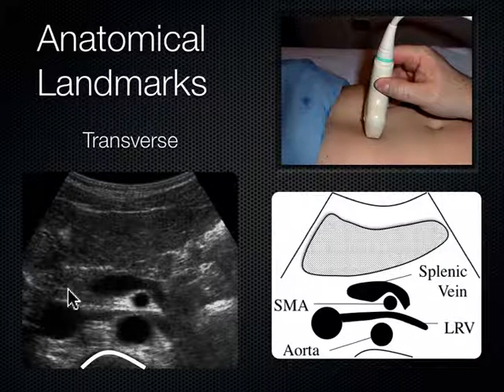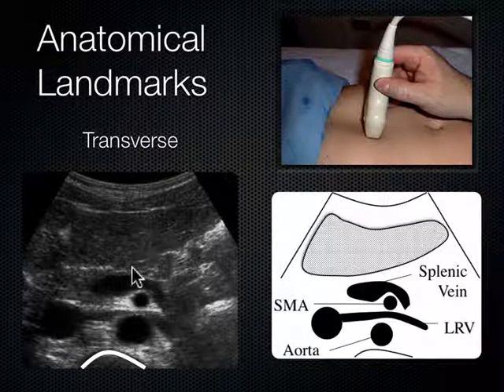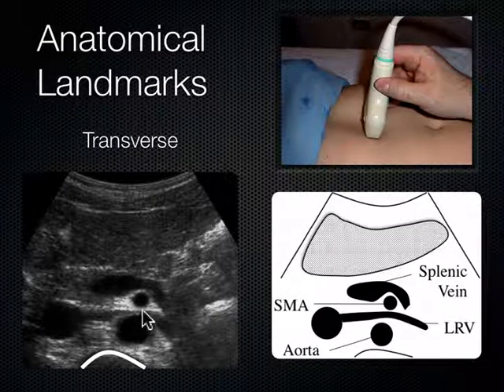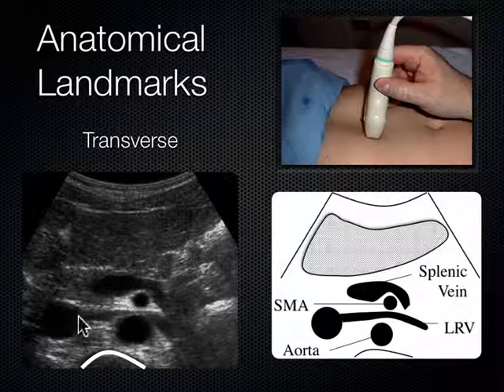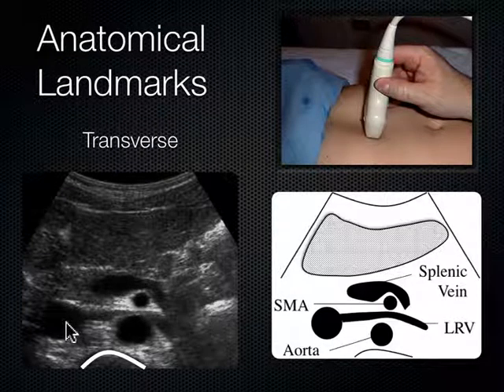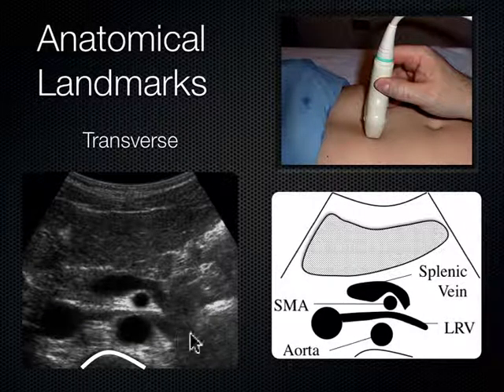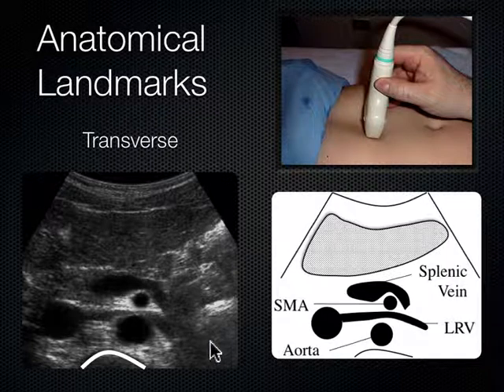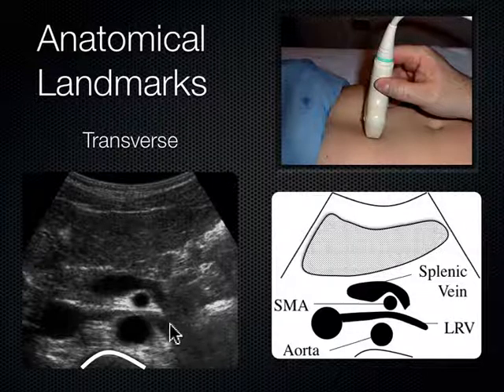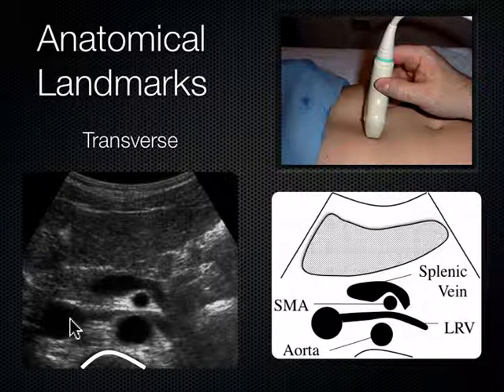Between the aorta and the SMA, there's a blood vessel that gets nutcracked between those two vessels and then dumps into the IVC — that's the left renal vein (LRV). The left kidney is over on the left side of the body, and analogous to how the right renal artery had to go behind the IVC to reach the right kidney, the left renal vein has to cross to the right side to drain into the IVC. It does so by getting nutcracked between the aorta and SMA.